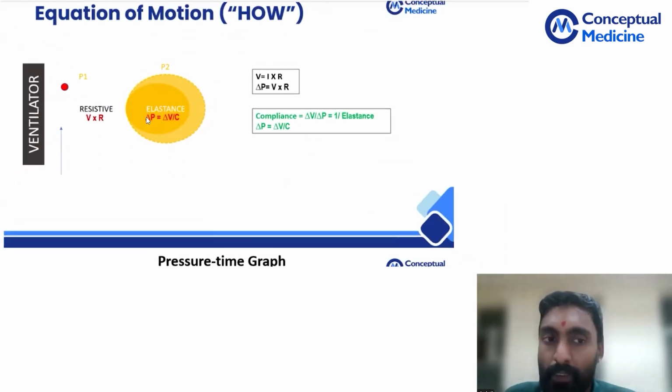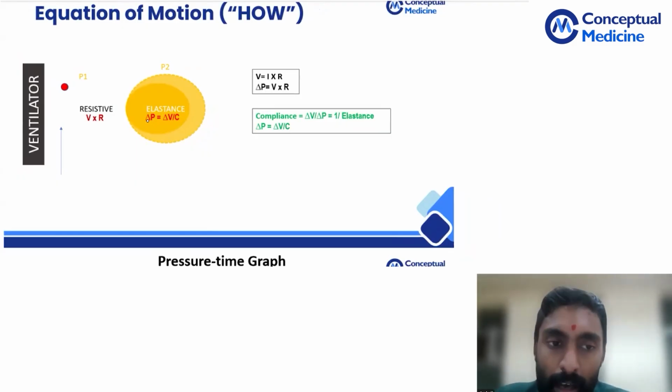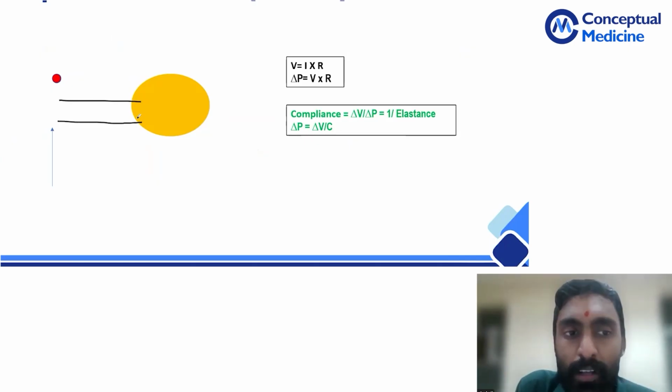So we know that our lung has an airway component and an alveolar component. Whenever I apply some amount of pressure, let us say the ventilator is going to apply a pressure. It is required to open up the airway. So we will take this as our airway component here. The initial pressure has to overcome the airway. Airway is the maximum area of resistance. It is just a conducting zone. You don't have much gas exchange happening at the level of the airway.